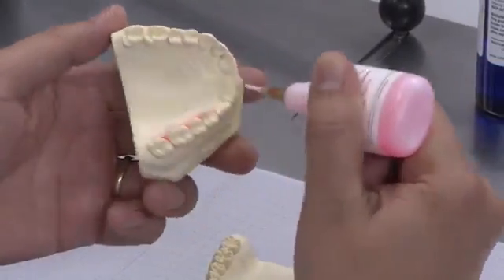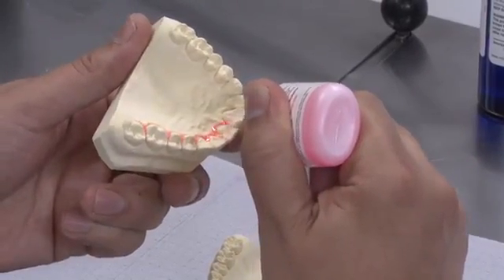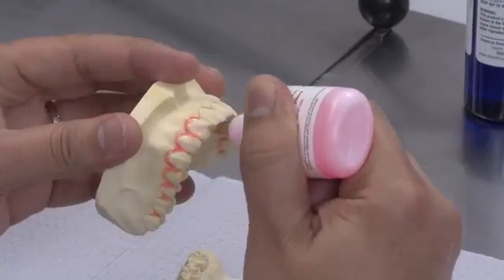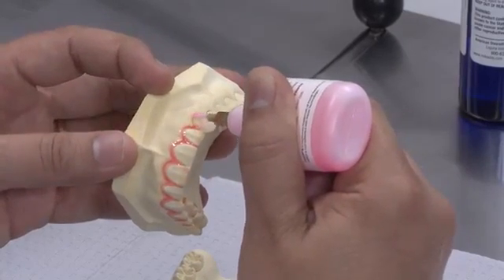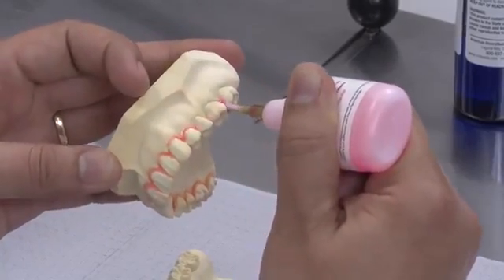For the hard Erkodur 2.0 material, you will need to block out all of the deepest undercuts, such as in the embrasures and the interproximal areas. The blockout material shown here is Adsit base. The technician is slowly going around the gingival areas and filling in all the deep depressions.